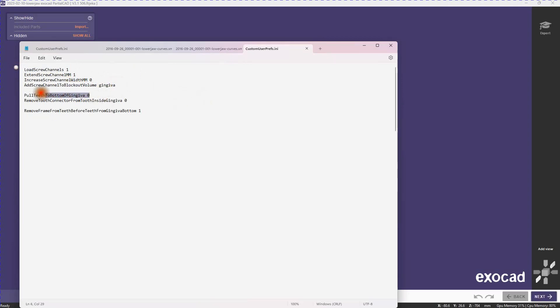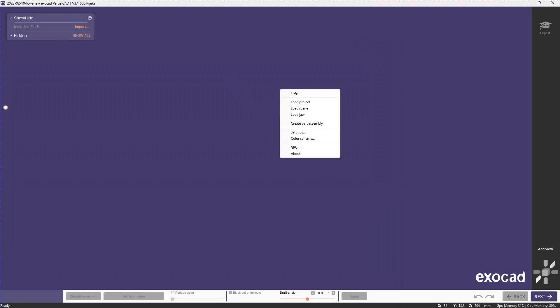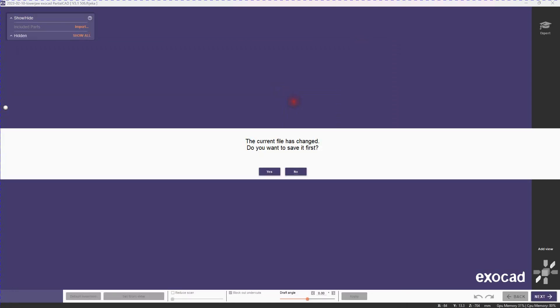Also pull the teeth down to the gingiva bottom. By default that's on and I turn it off in this case because the teeth are so high. And then finally the last one just changes the order of how parts are assembled.